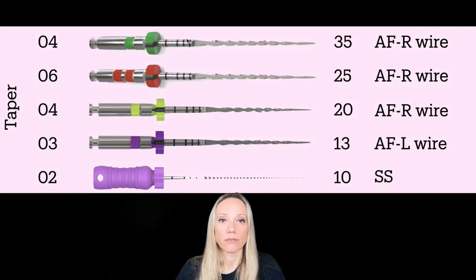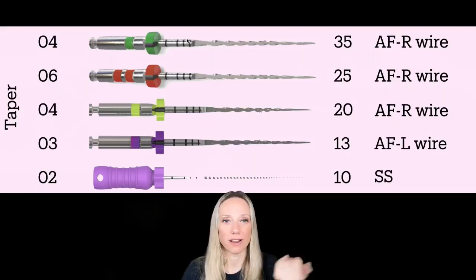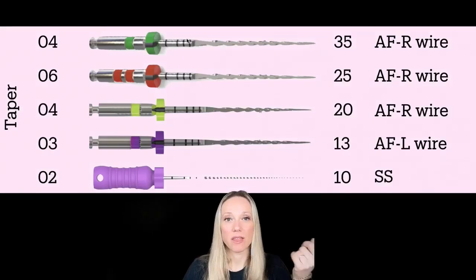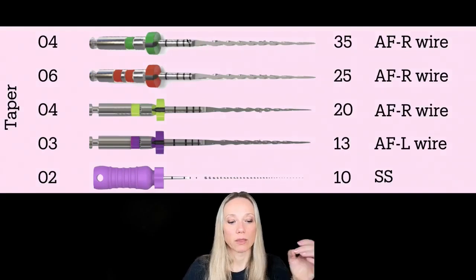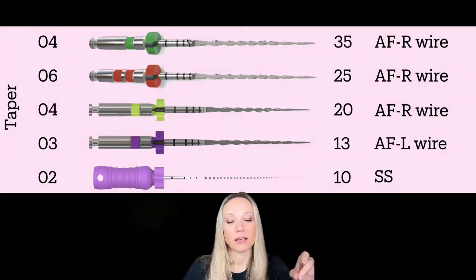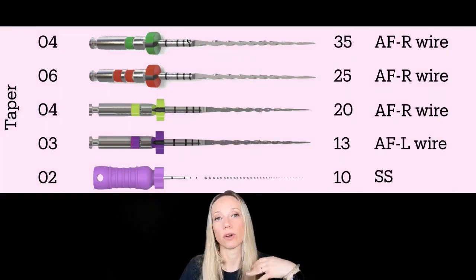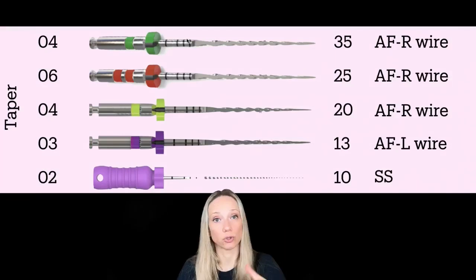First of all, we have in our package a number 10K file, taper 02, tip 010, the regular one, done in stainless steel. This helps us in our glide path, working length measurement, etc. Then we have the 1303. The 1303 is made in AFL wire and is the first file of this sequence. It's the file that we are going to use to make our glide path and to arrive to the apex.